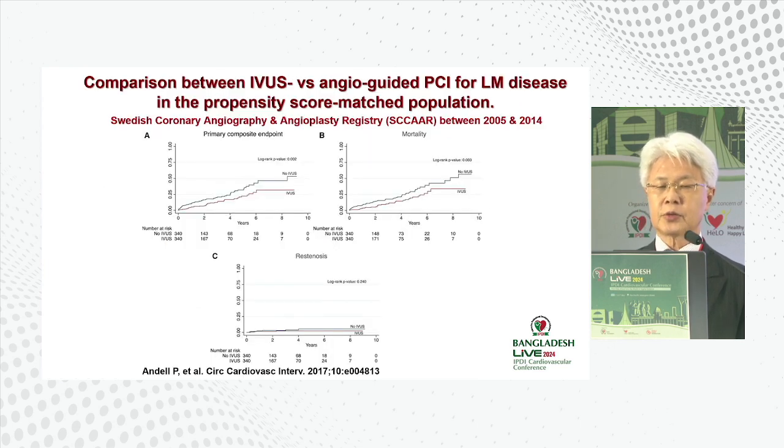And comparing IVUS-guided and angio-guided PCI, this is the Swedish Coronary Angiography and Angioplasty Registry, the SCAAR registry. Compared with angio-guided PCI, IVUS-guided PCI demonstrates a better prognosis.